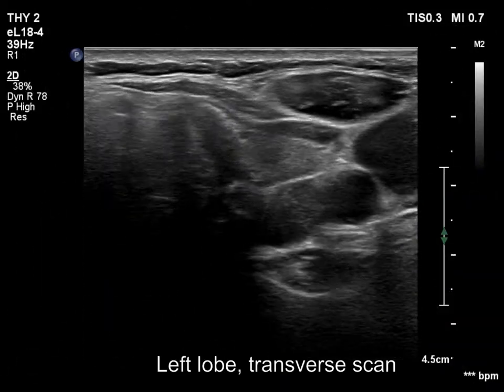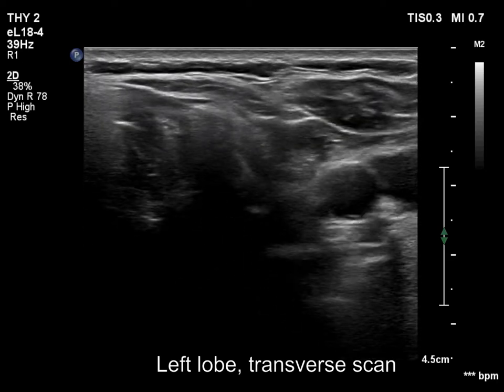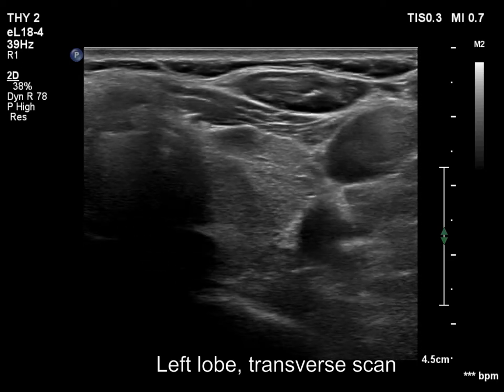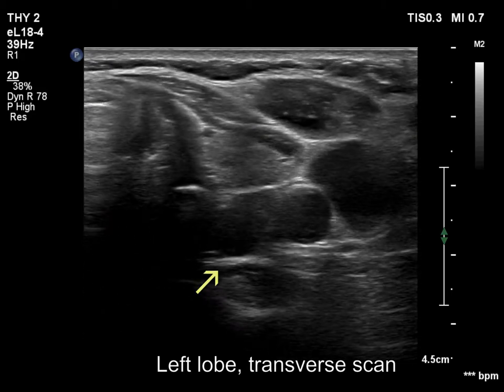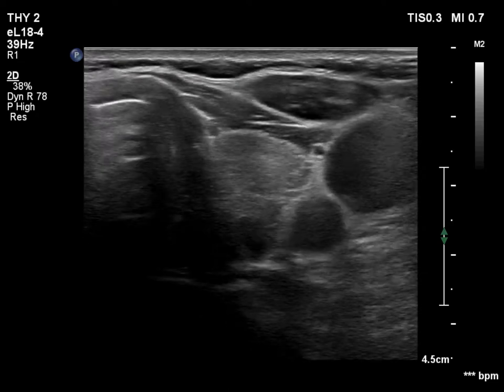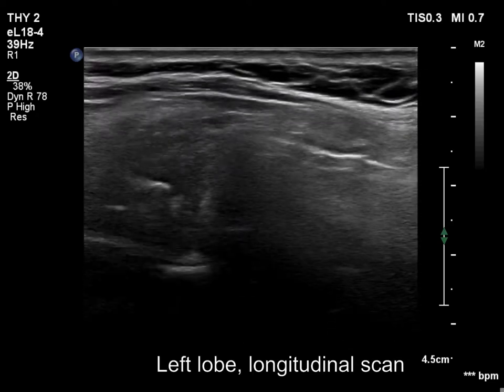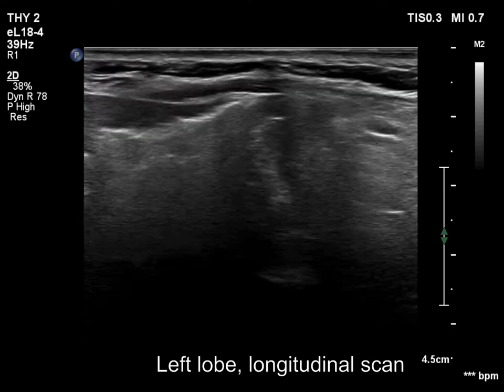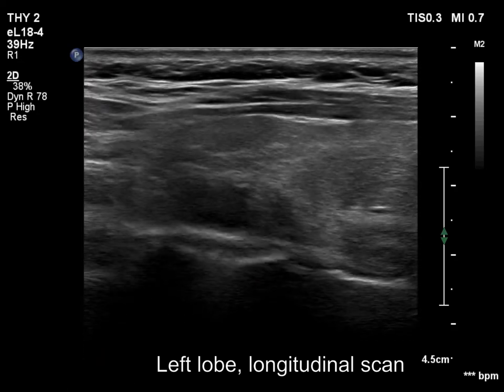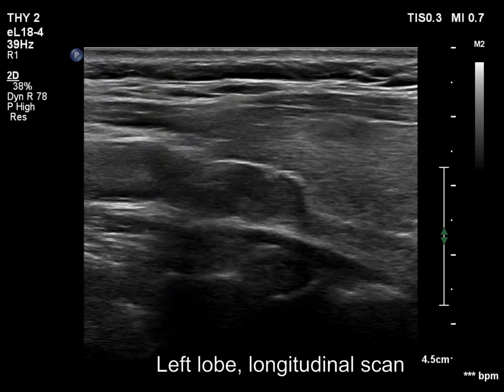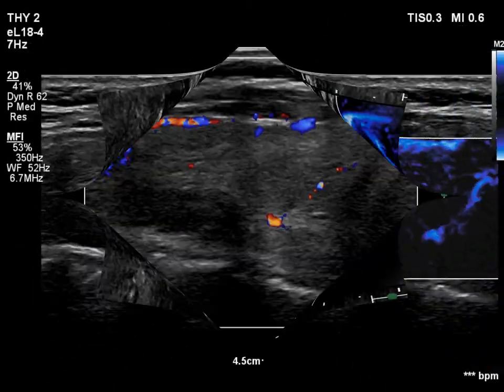The left lobe has a hypoechoic mass in its dorsal part. On transverse section, it is difficult to visualize the small mass. On longitudinal scan, this is much better to visualize. The vascularity is not characteristic.